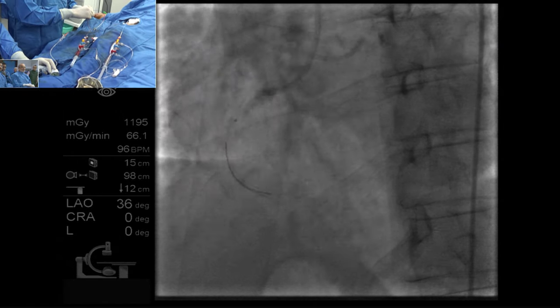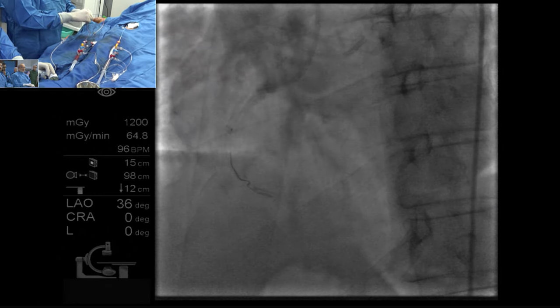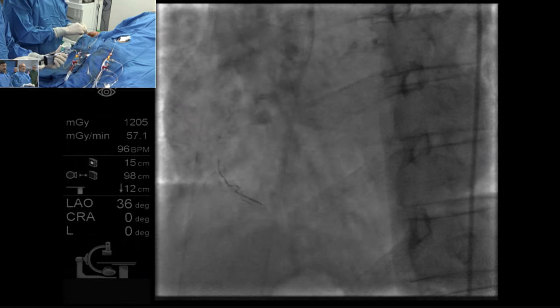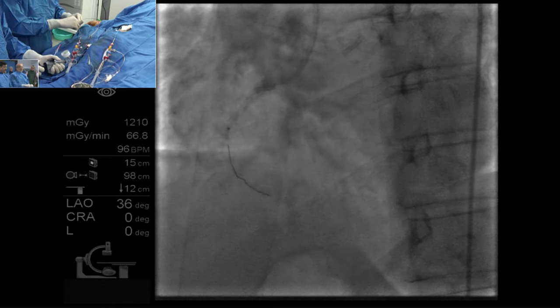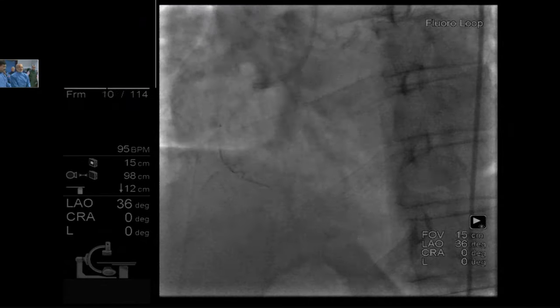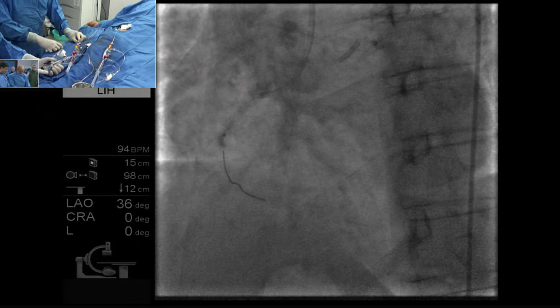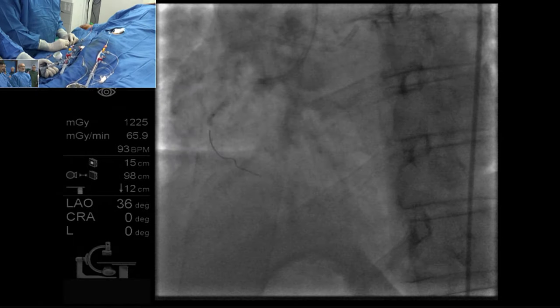There is no significant side branch. No, there is no good option. Pull here? Dilate here? Okay, yes. Pull here. Pull out there. Yes, it has gone in. Deflate. Puncture, rupture? Nothing ruptured. There is a lesion. Yes. You can go even higher. 15, 16. It's gone. Rupture.